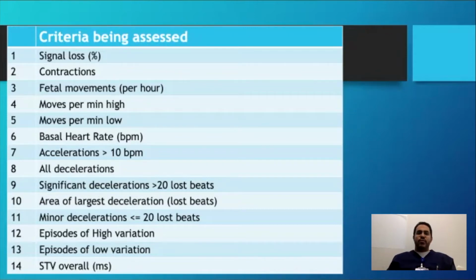It's looking for baby's movements, and it calculates that per hour. So if you have somebody coming with reduced fetal movements, she's had a 10-minute CTG trace, and she has 2 movements on there, and then you read, well, it's saying it has 12. It didn't pick up 12. It's estimating that if we carry on, this is likely to have 12 movements within the next hour. Right? Even though all you could see was 2.